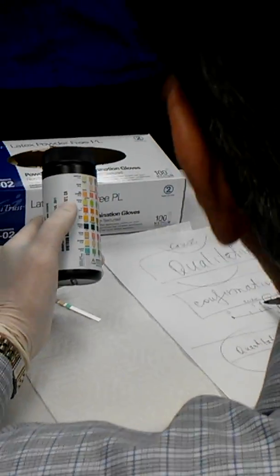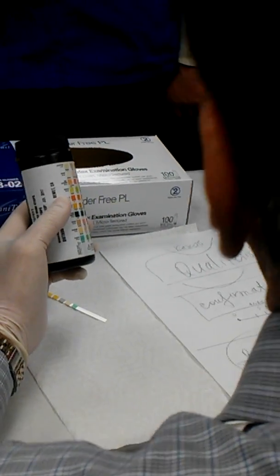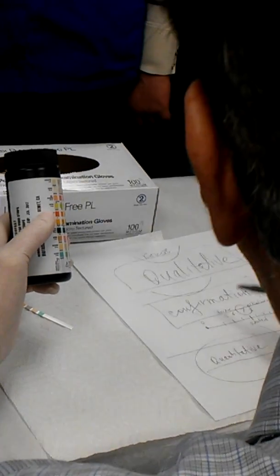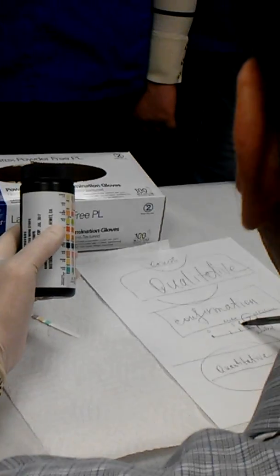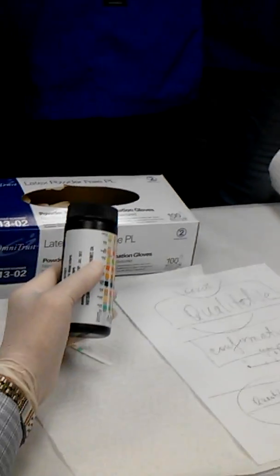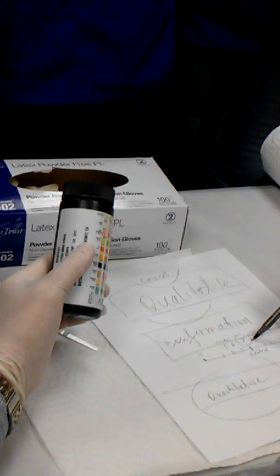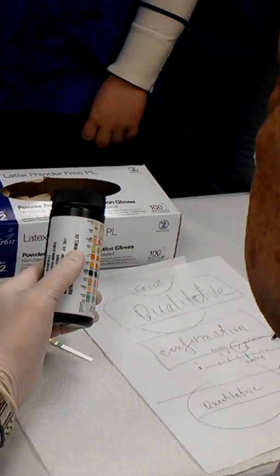So if you have 6, it's okay, because if urine is acidic, it will be killing microbes. So it's better when you have 6. And it's not dangerous, but it's a predisposition to infection if you have 8, 9, and 10.